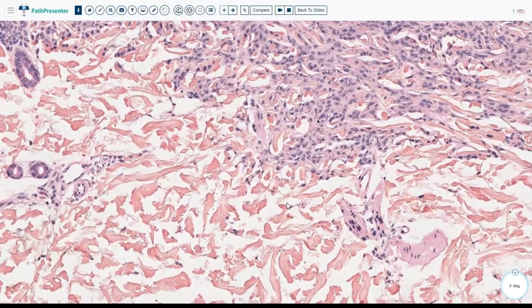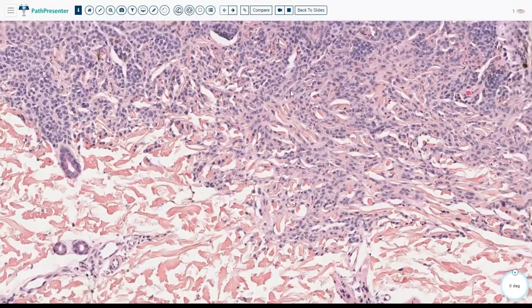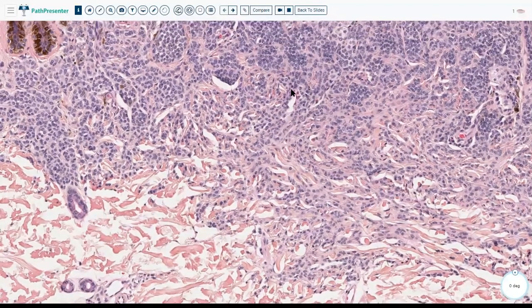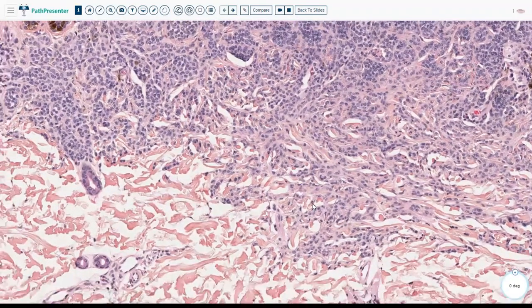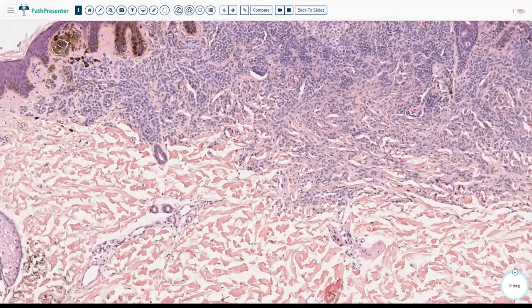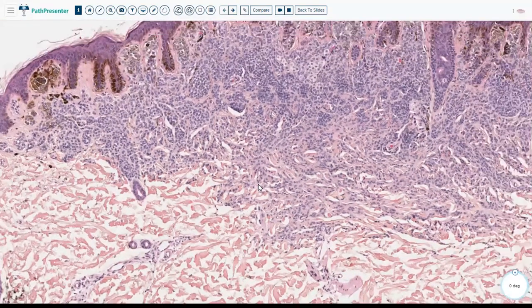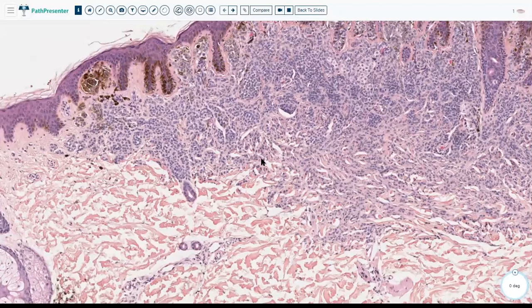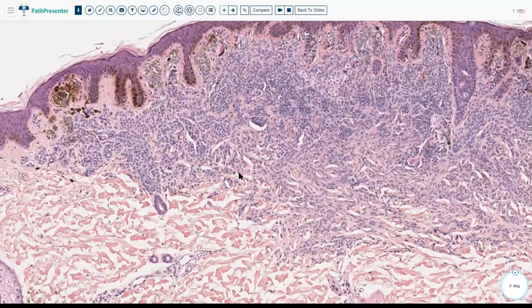So if we go back, look at just as an outline, you can't compare the size. See how giant they are in the top with their large nuclei, and see how tiny they start to become and scattered they become. That's a strong indicator that the lesion is a normal nevus. And you make use of this feature not just for regular nevi, you make use of this feature in Spitz nevi and some blue nevi and many combined nevi. You always have to note maturation from the top to bottom. And this lesion shows perfect maturation.